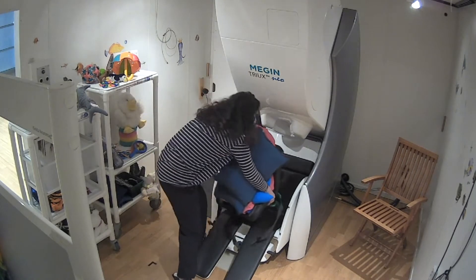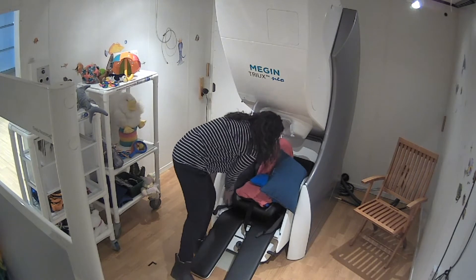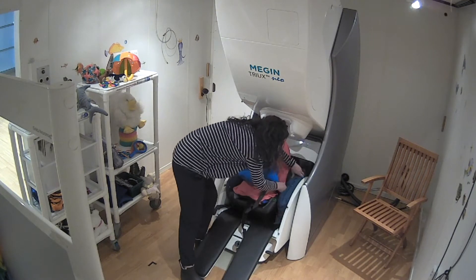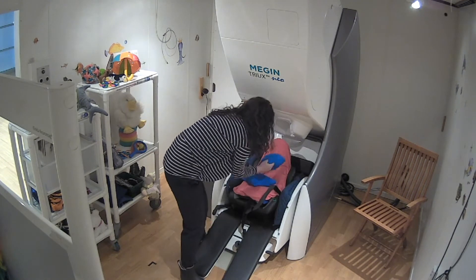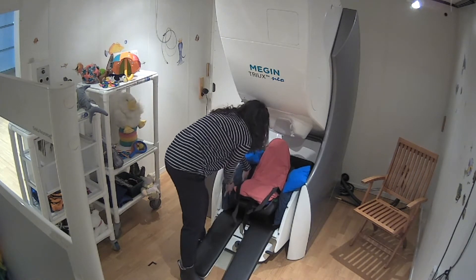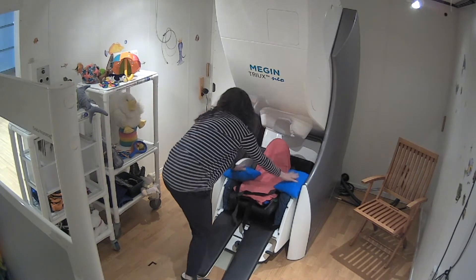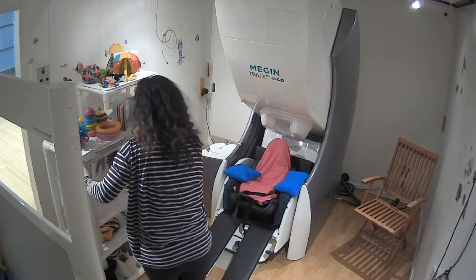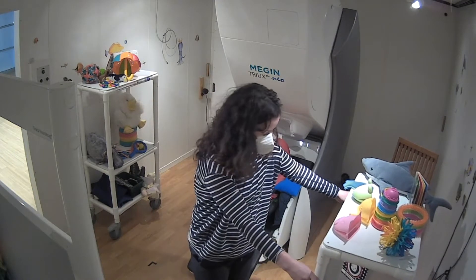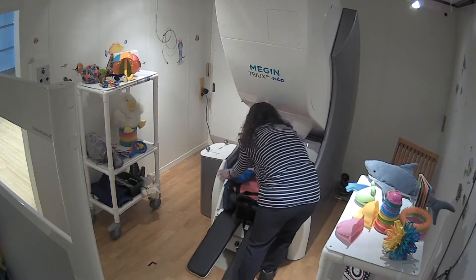Inside the MSR, it's important to have a setup that is comfortable for the infant. It's also very important to have an area where the research assistant stands and engages the infant's attention using toys. Our adult MEG chair can be adjusted easily to make it suitable for infants. We have chairs to accommodate all sizes, from young infants to adults. Here, we added an infant seat angled so that the head is properly positioned inside the helmet. This position not only provides a comfortable seat for the infant, but also allows for good signal-to-noise ratio in the MEG. We have pillows and blankets that help support the infant.